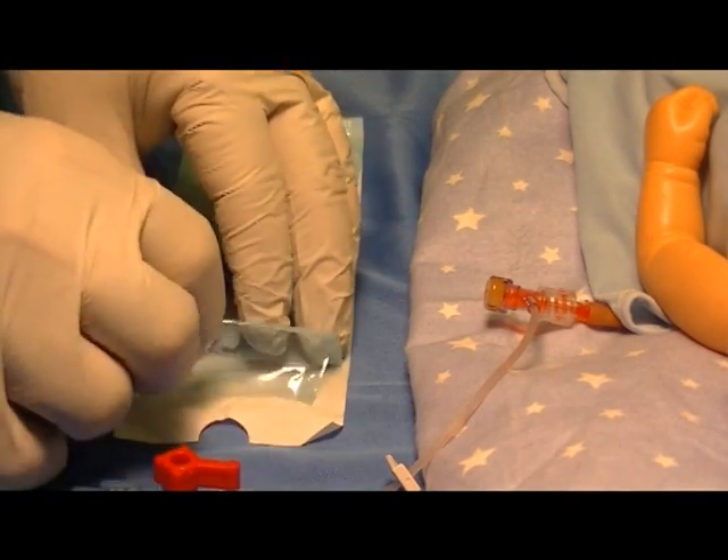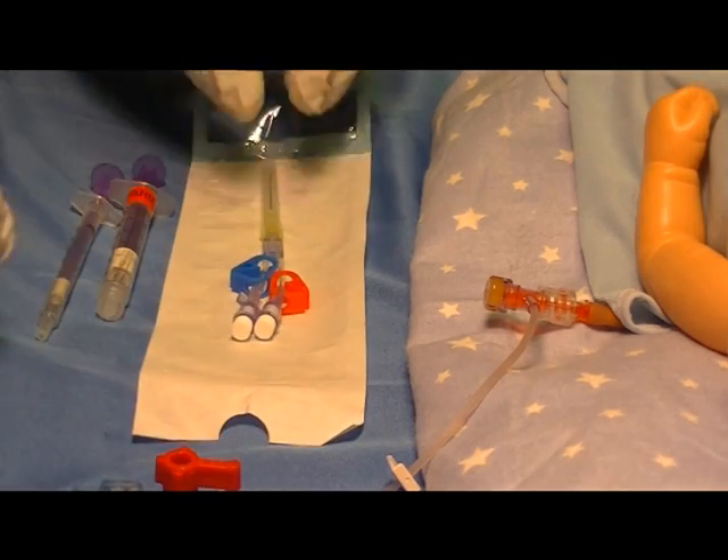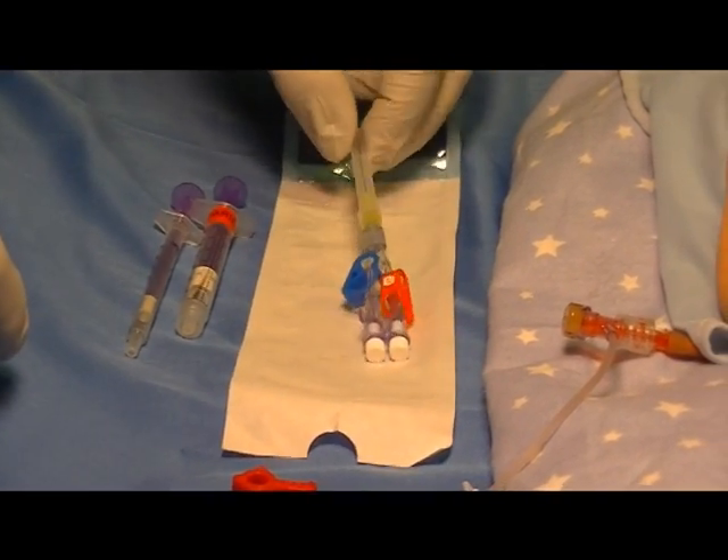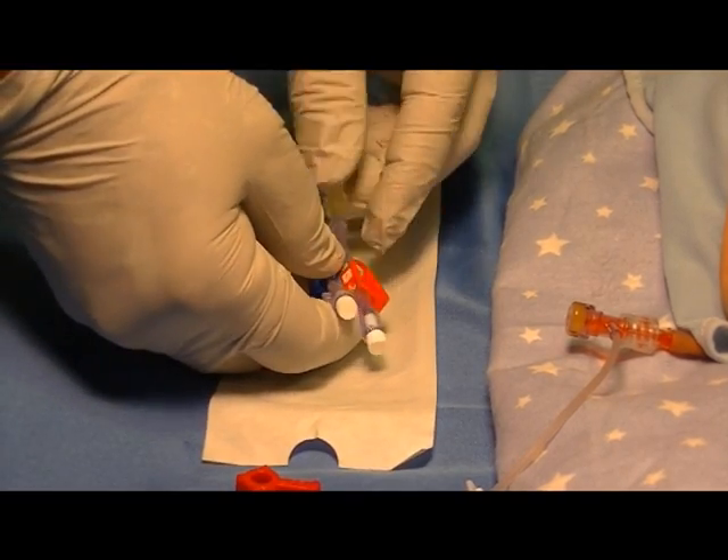Next, open the Humi micro draw device and inspect it for integrity. Make sure the sterility cover is in place, along with the white vent plugs and the clamps.